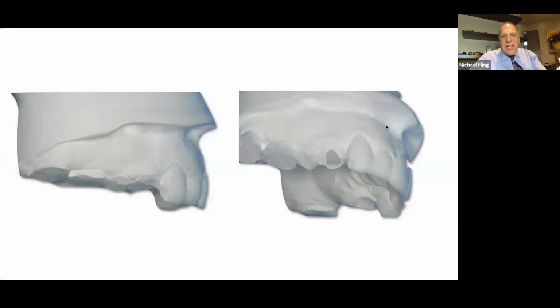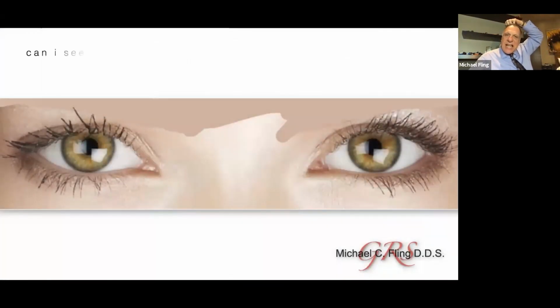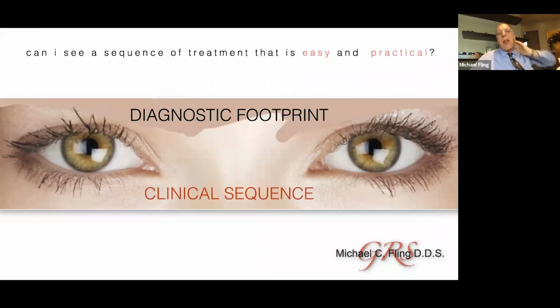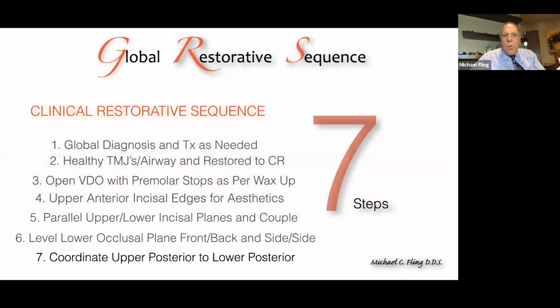Here, I've waxed the anterior on this gentleman. Here's his back teeth. So once again, that's cut all the way down. I've just simply added teeth, waxed the axial contours. It goes very quickly. So as I would do this technique in the lab, I thought to myself, is there a way I can apply this in the clinic to make it go more quickly? And that was kind of the invent of what I did with these composite overlays.